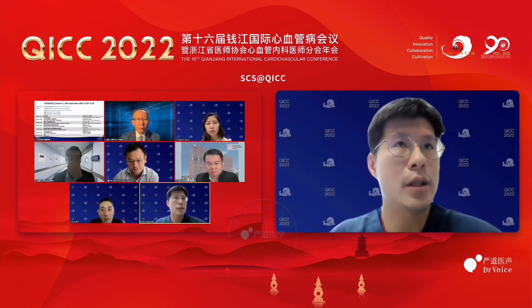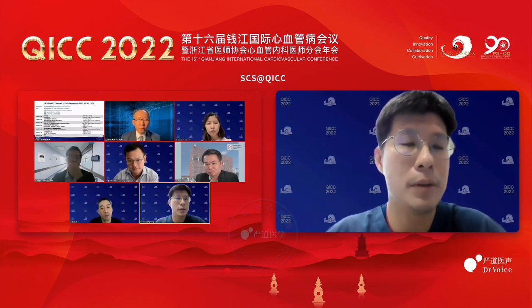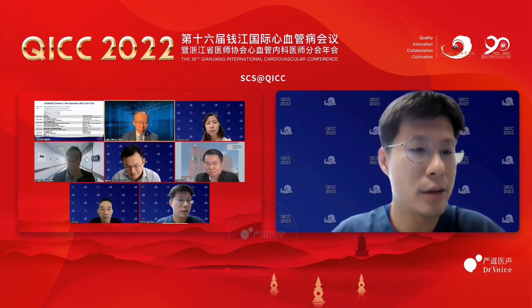We don't need contrast media for IVUS, and the resolution of IVUS is a little bit lower. However, OCT has a higher resolution. So this is your criteria, right? To use IVUS or OCT for PCI. Is that true? Yes, correct. Thank you. Okay, thank you very much.